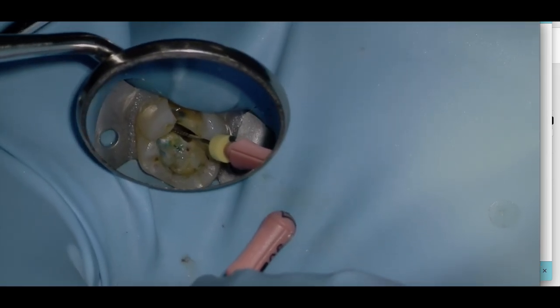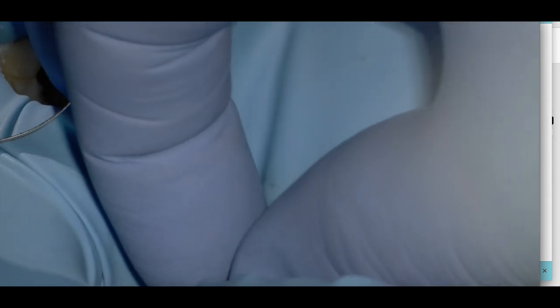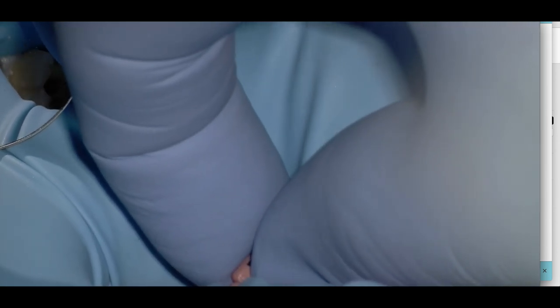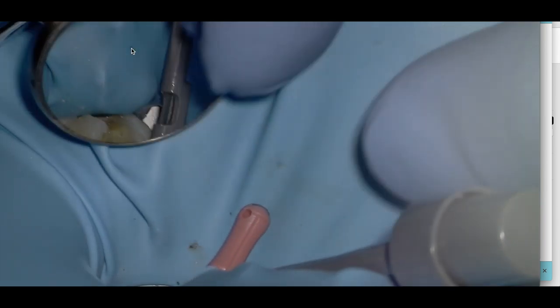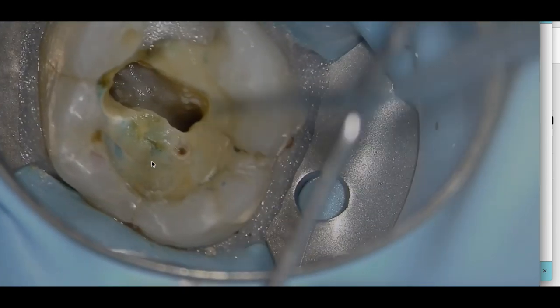Now I've opened up the coronal two-thirds of those canals. I'm going to take my number six file. I've honestly started to use a number six file routinely rather than starting with an eight. You can see I've made a little bit of curve and I'm dancing the file around according to the unidirectional technique. I'm down the distal buccal, and typically if it doesn't drop there's going to be a little hook going towards the distal. I can use my apex locator. Let's get an initial working length and do that for all our other canals.